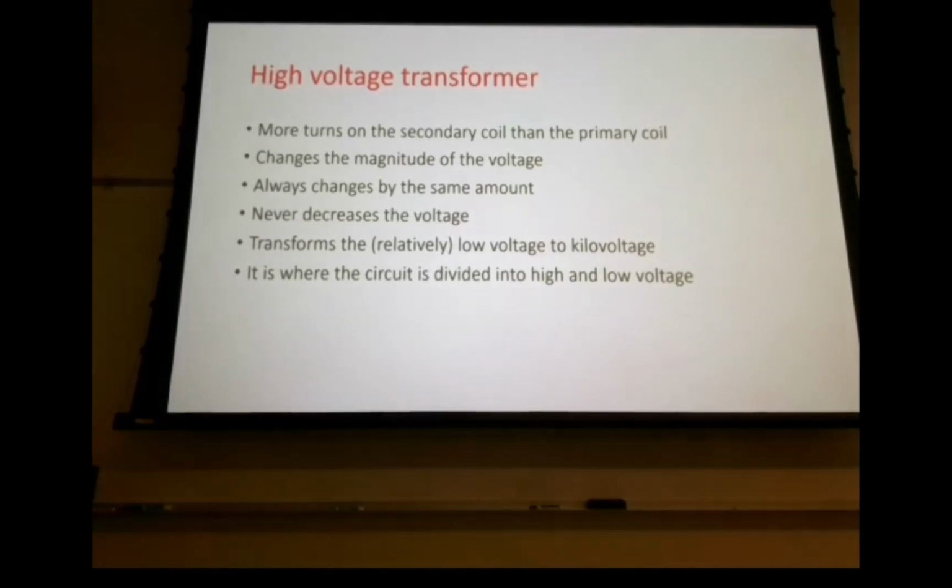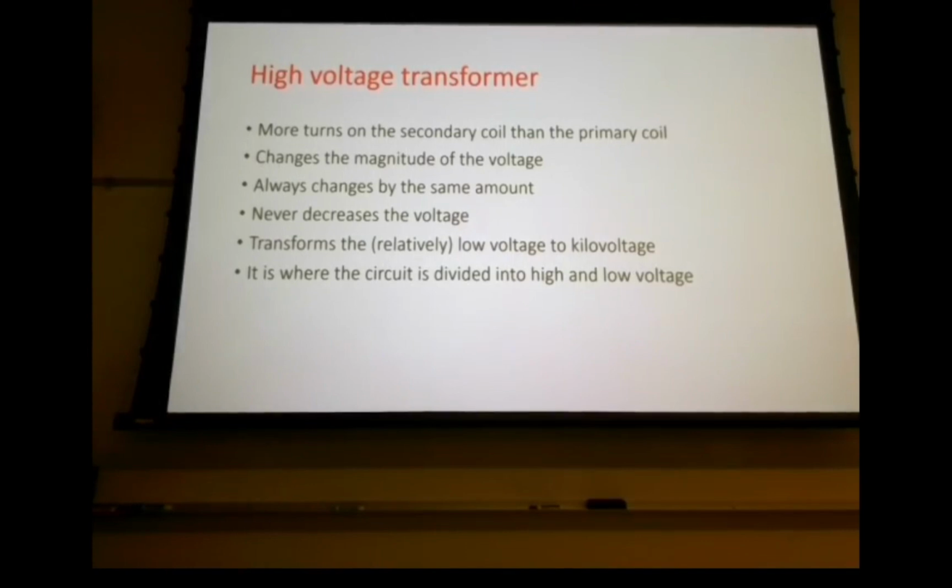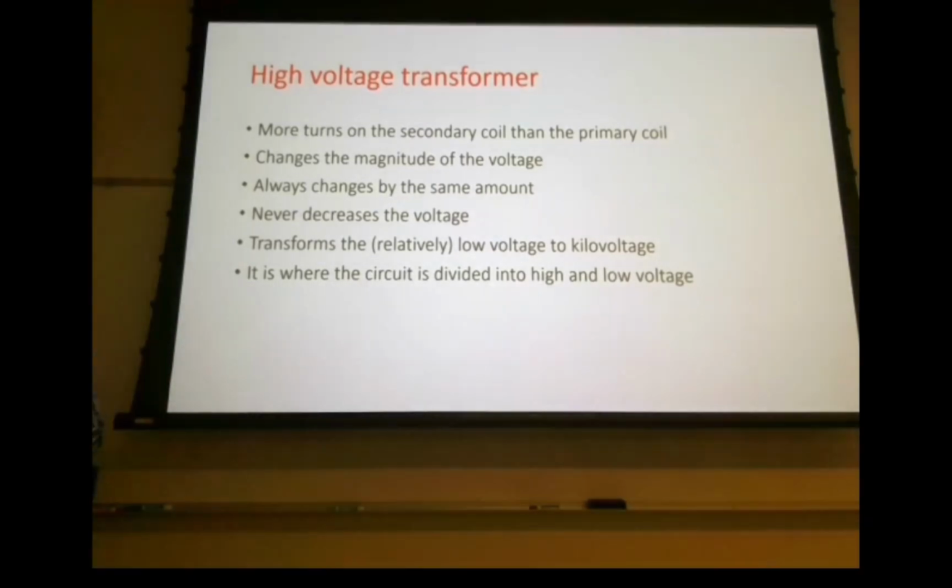Okay. So our auto transformer, all it does is we can change our voltage, and then the kVp meter reads voltage, and then it turns into kilovoltage at the step up. Right. If we get it right at the auto transformer, then we know it's going to be right at the step-up transformer.